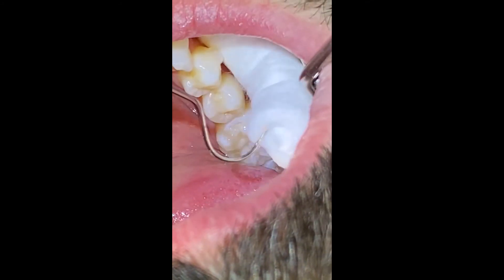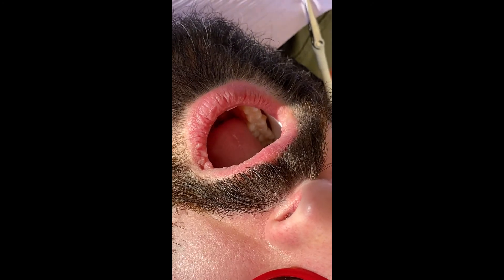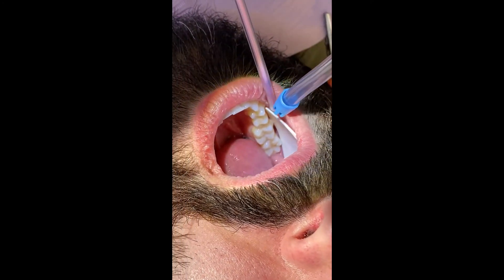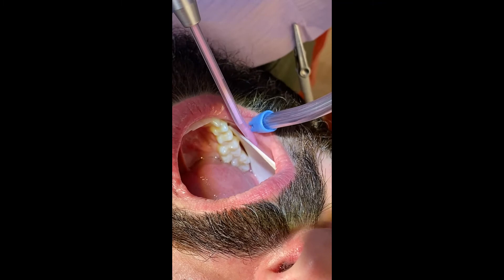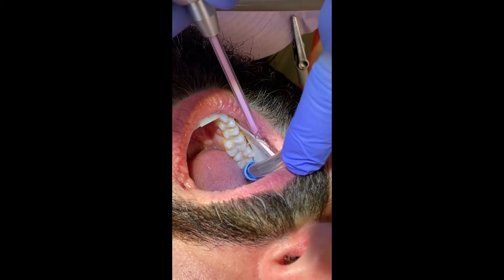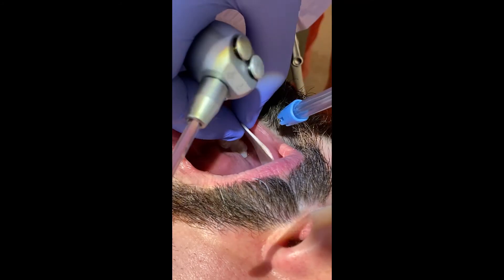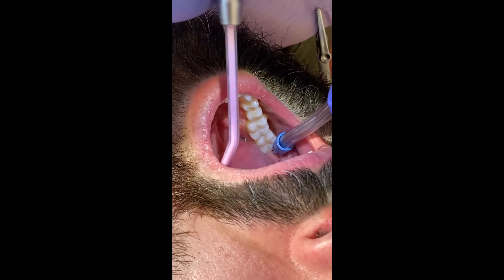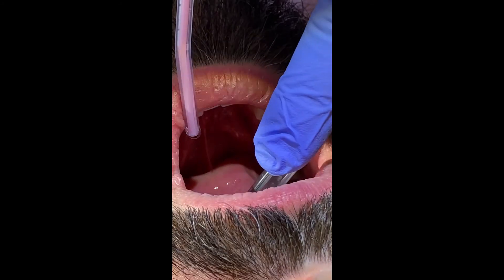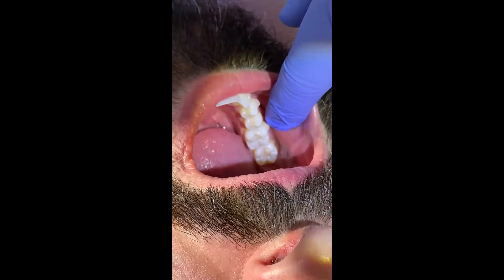Once you've determined that it's a good sealant, you can remove your cotton roll. Do not remove your dry angle without using a little bit of water. I place my suction right next to the teeth and apply a little bit of water while running my air water syringe right underneath. Once it seems pretty loose, I take that out. Give the patient a little water, and this is going to be your finished product.